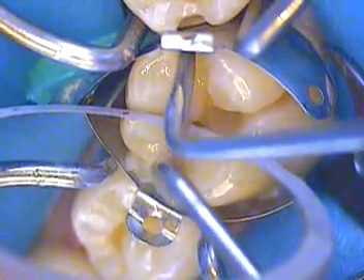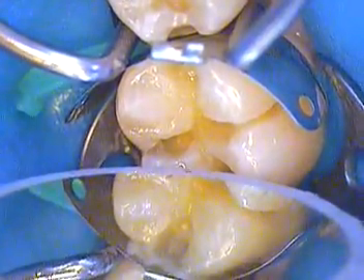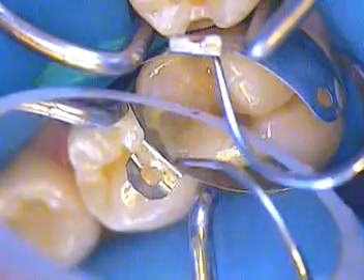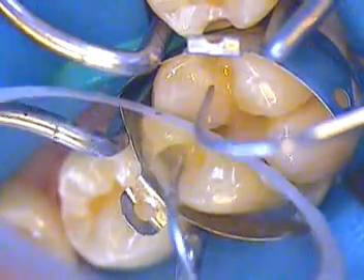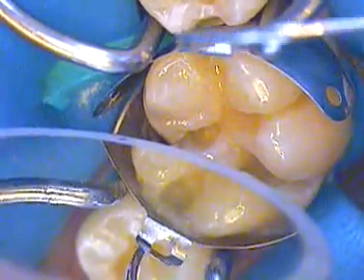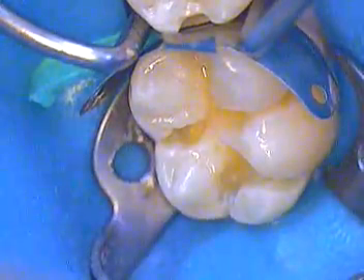I'll take an explorer right now to take away some of the excess and get that out of there. That looks good. We'll go ahead and cure that — that's our first cure.